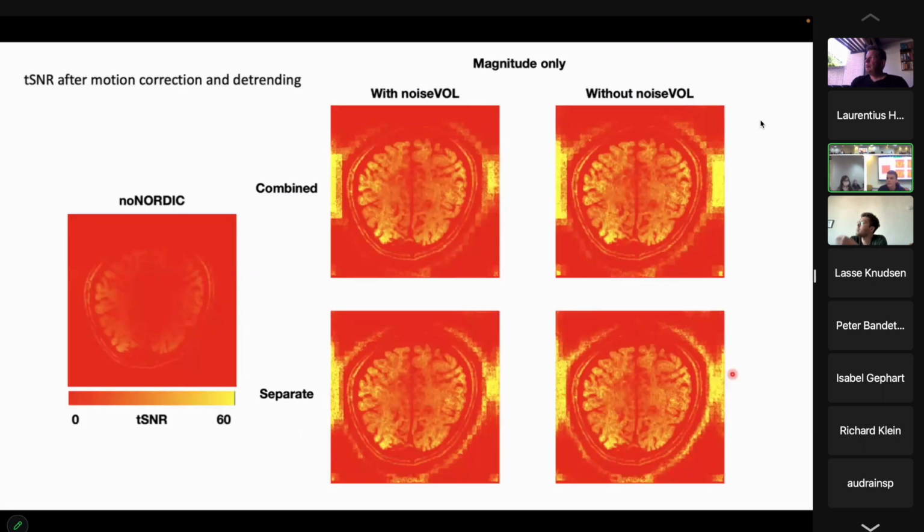As in, in each of your patches, there's no mean removal before and you add it back in. It's like part of the analysis, but okay. Yeah, I don't know. I would have thought that it would remove the mean to begin with, since it is PCA, right? But I'm not 100% sure how it is in NORDIC. Okay.